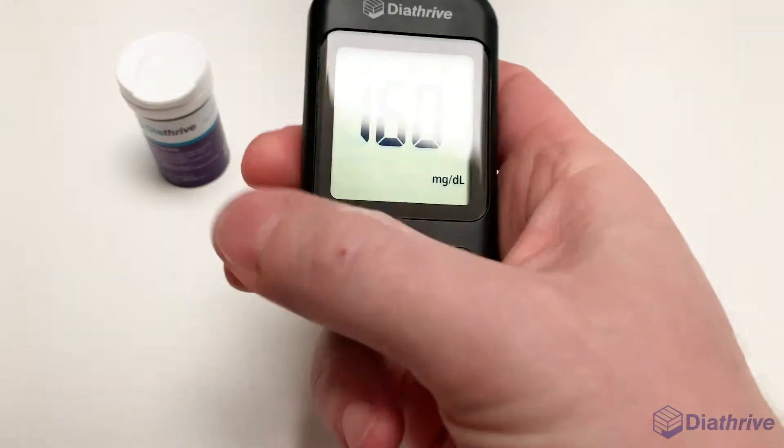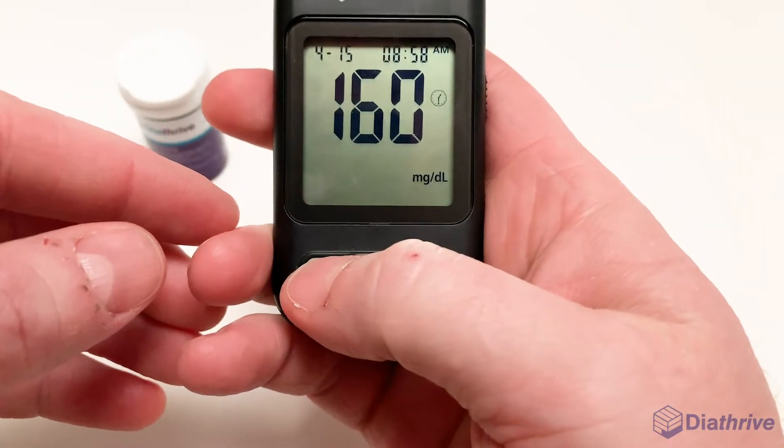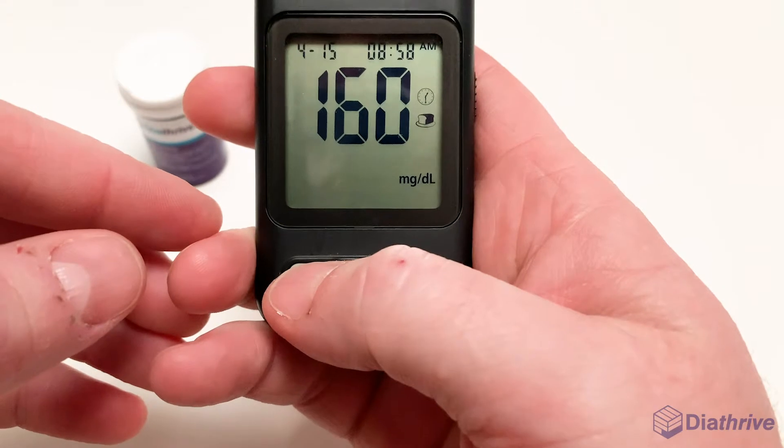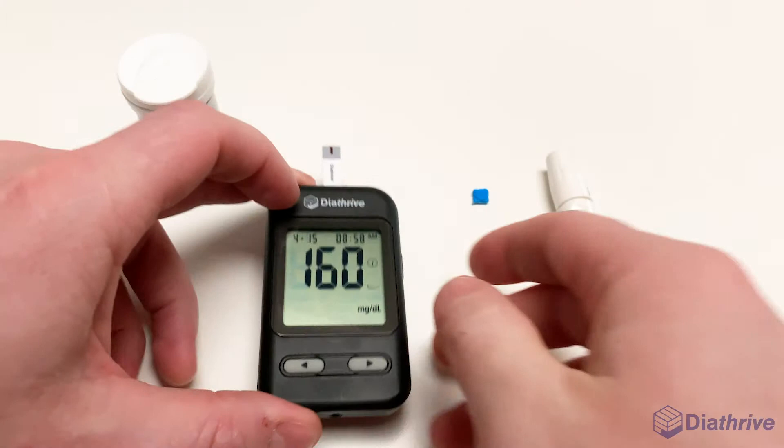Before the number disappears from your screen, you can apply a little context to your reading. Press the left button to label your reading as pre-meal or post-meal, or to exclude the reading from your averages. Press the right button to save.